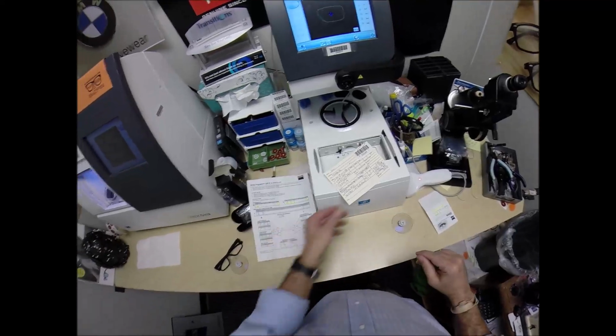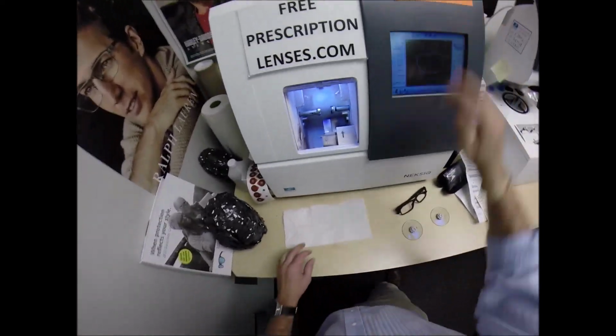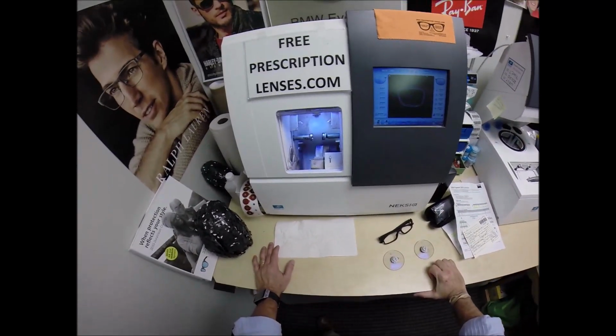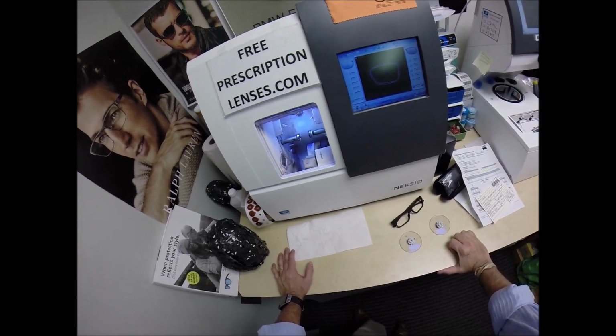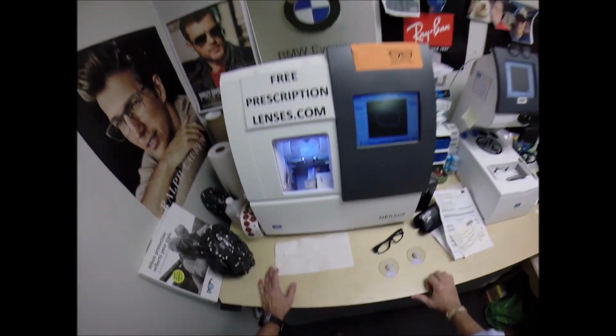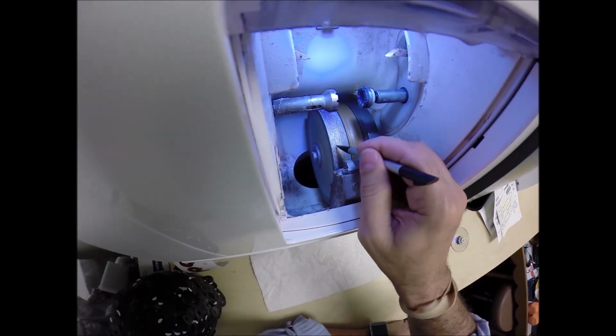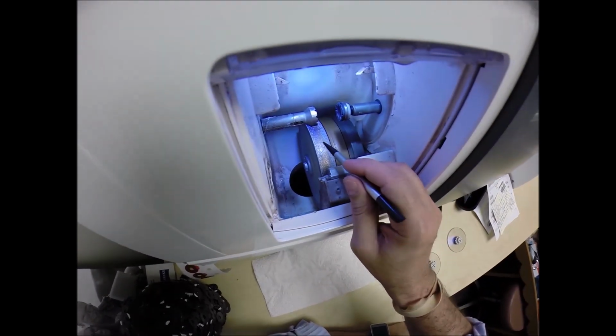So, let's see here. We've got, that's done, that's done. Let's come down here. Now this is the edger. This is what costs $40,000. It weighs 200 pounds. I recommend everyone go out, buy their own, put it on your kitchen counter. Then you can cut your own lenses at home, and you won't need this guy with the two thumbs to do it for you. But the actual cutting wheel is this diamond crusted wheel that's going to grind away your lens material till it's the final size.